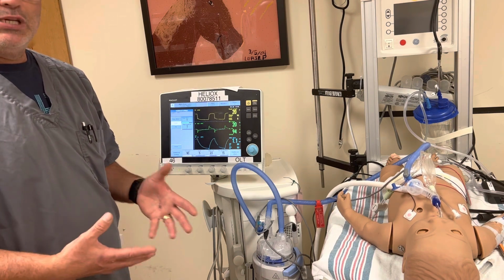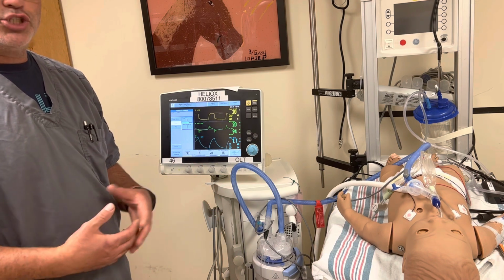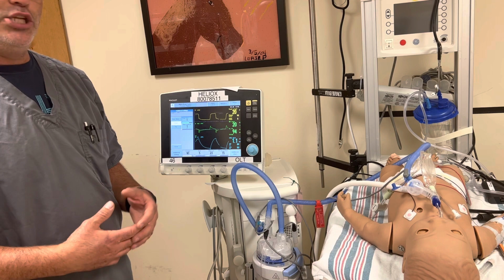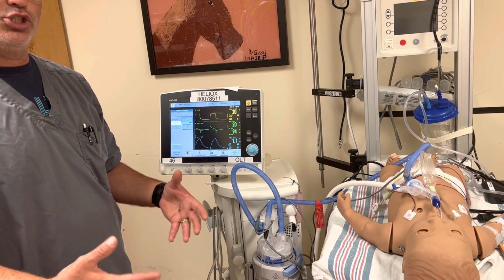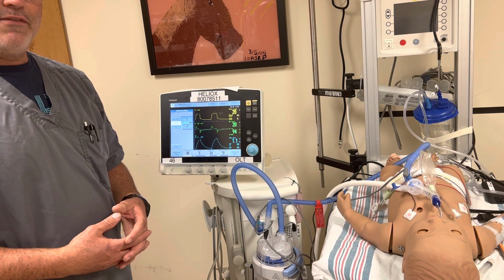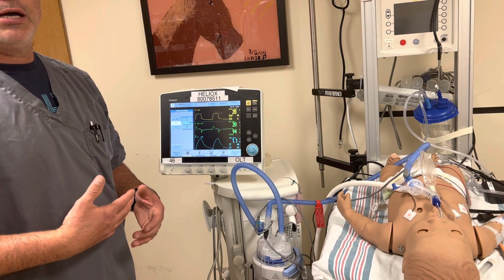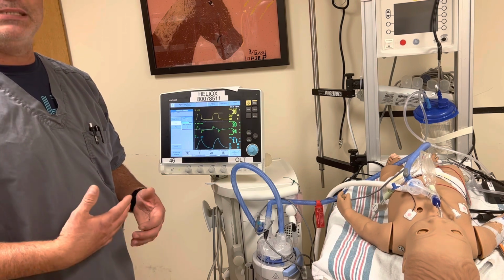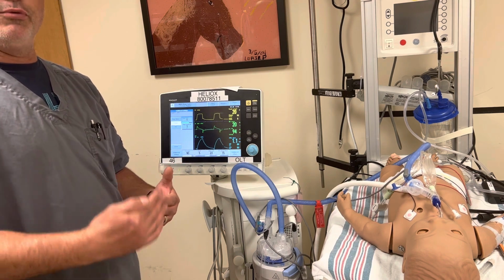Well, if for some reason it's stretching too far, the blood pressure might be within normal range, but the aorta might stretch too far. The vascular bed down there might stretch too far, and when it does, it hits the diaphragm, and when it hits the diaphragm, every beat of the heart causes the aorta to kind of bump the diaphragm, and then when the diaphragm gets bumped, it moves flow through the vent circuit.